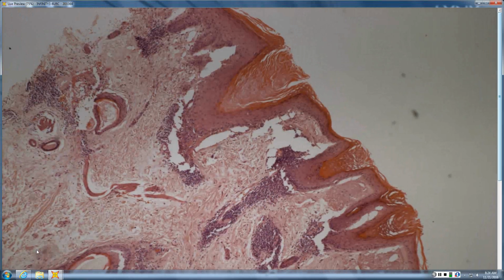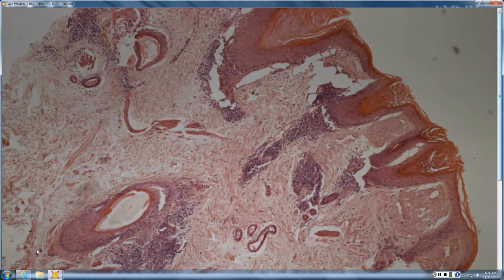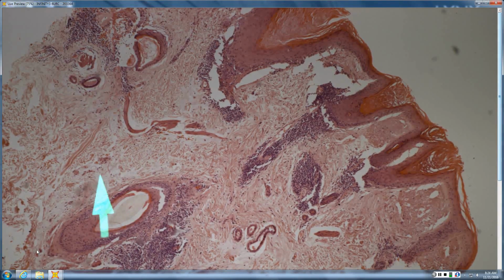So you have a superficial and deep infiltrate, really lymphocytic. There's a lot of clefting. I still kind of put this in the interface category. So it's an interface category, thinking lupus erythematosus. So lupus, it likes what portion of the hair follicle? Mid-dermis, isthmus. Okay. LPP stays up by the infundibulum. Lupus loves the isthmus. What's all the space between the collagen about? So probably mucin. Probably mucin, so I agree with lupus.